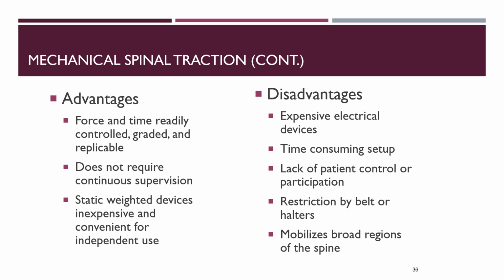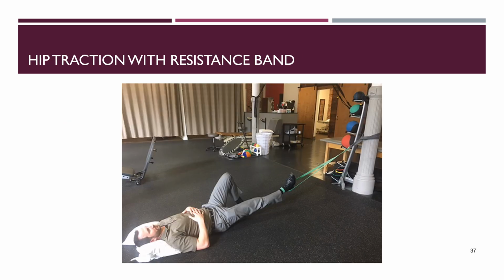There are some different advantages to mechanical traction versus manual traction. I really wouldn't worry about these too much. But I do want to talk to you now, this kind of last section here talks about hip traction and distraction with a resistance band.